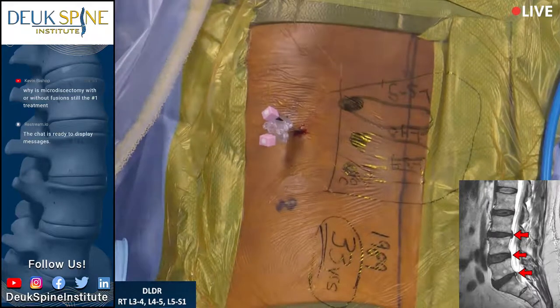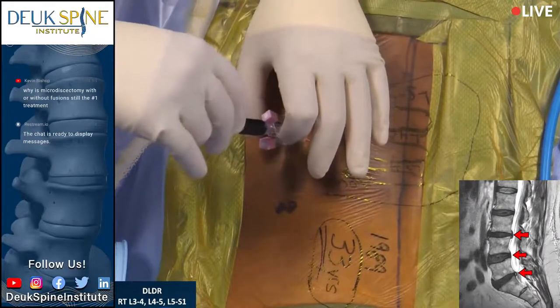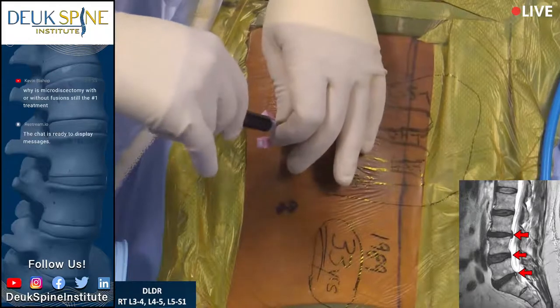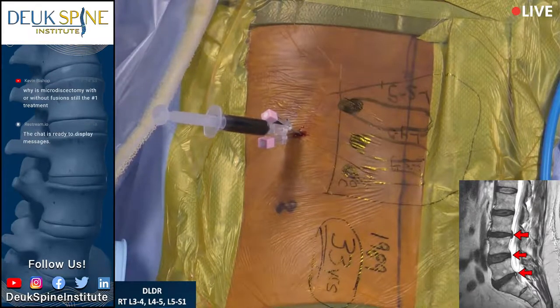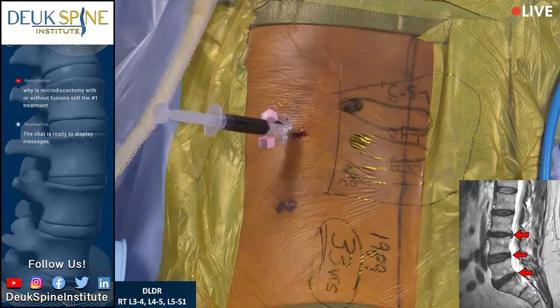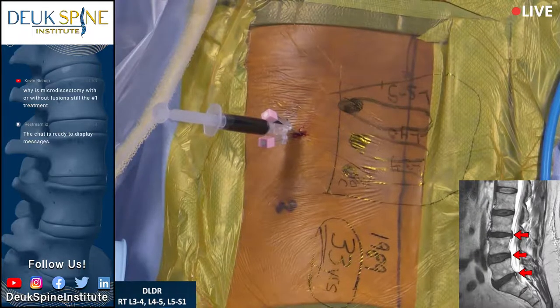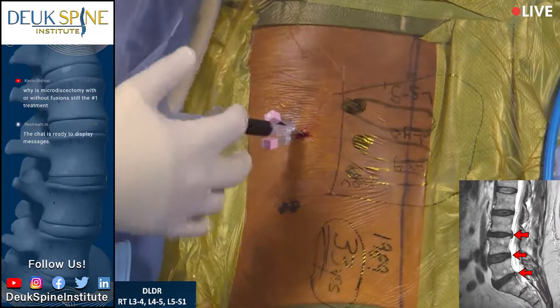Are you better now? And he's awake, we need him awake to talk to us. And we're gonna test this, but after we're done with this, Flynn, I want you to run the video on, again, why do people get back pain from a herniated disc? What's the cause? What's the mechanism there? Are you comfortable? Yeah. All right.